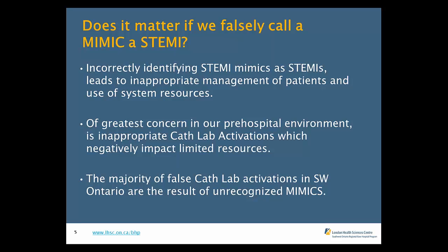Again, the ECG is only part of the puzzle. Now, we expect for a code STEMI to be activated that the patient needs to be having chest pain first off. So sometimes ST elevations are caused by STEMI mimics, and the patient is actually having no cardiac or respiratory symptoms occurring, which kind of goes against this being an ST elevation MI. So again, think of the ECG as just another piece of the puzzle. It's looking at the whole picture, not just the ECG itself.